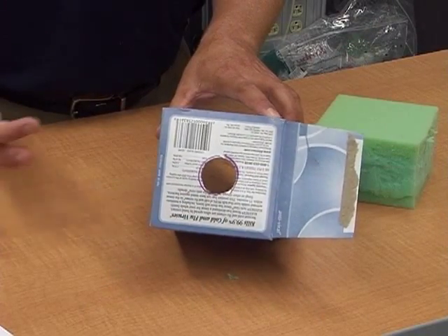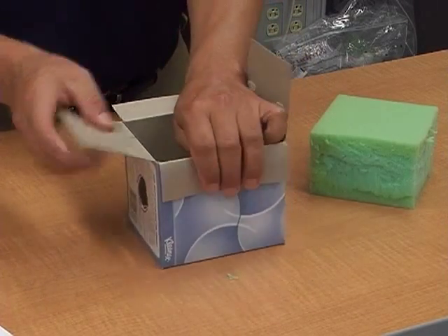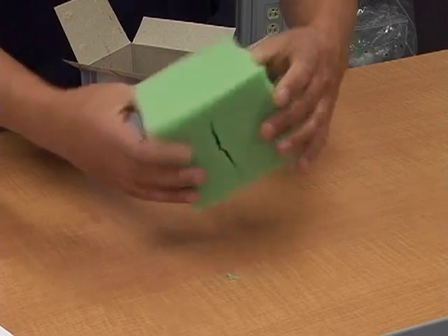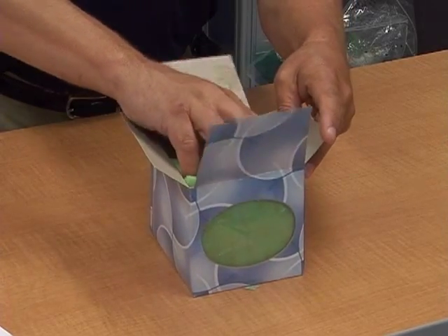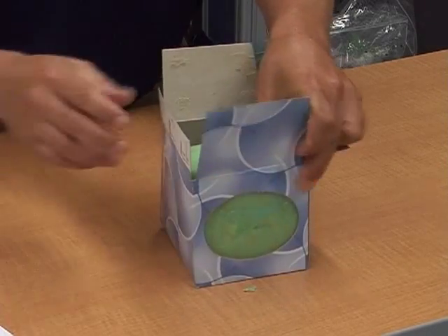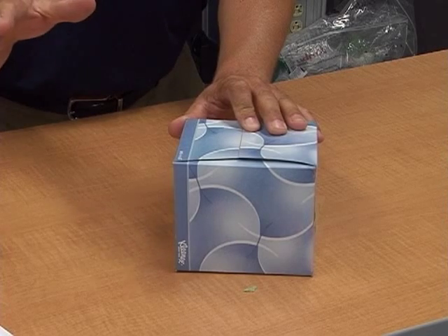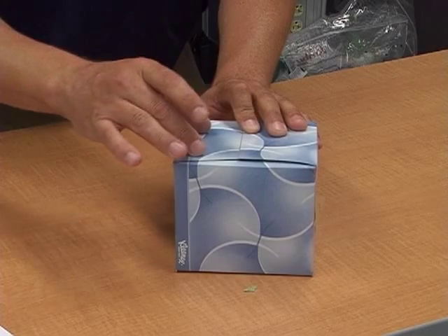Now that we've got our hole cut, we're going to place our foam that we pre-cut earlier. We put a slit in the foam to simulate the vaginal canal. Take the foam, line it up with the open end of the box, slide it in, and make sure the slit is in the front. Then close up the box and seal it with a piece of tape — but don't put too much on, because you'll want access to change the foam or add anything else.